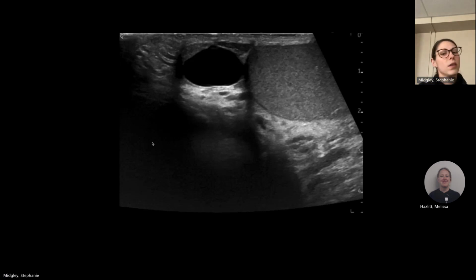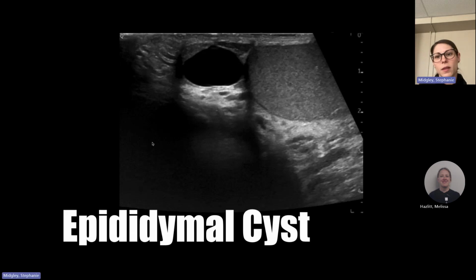What's this one? So what does it look like? The cyst, yeah. Where is it? Yeah, epididymal cyst. Nice.